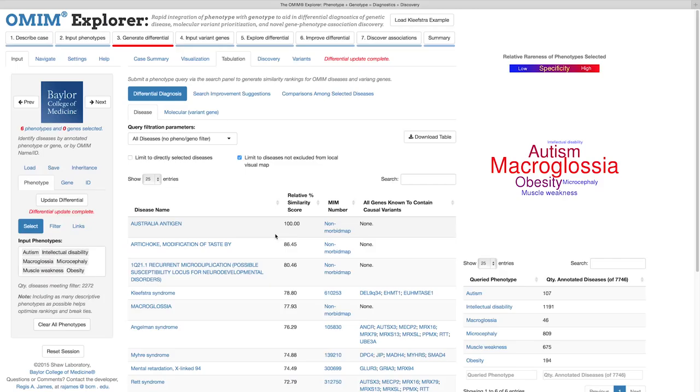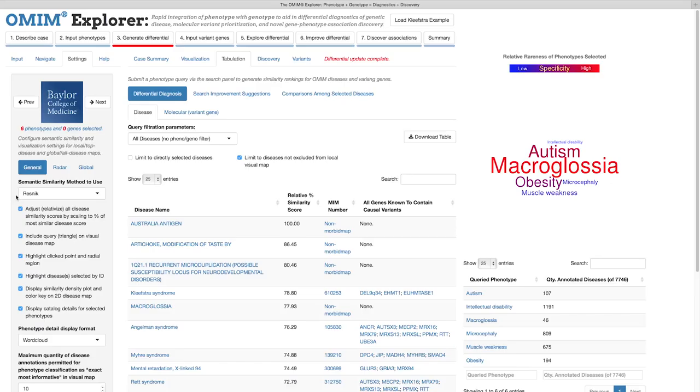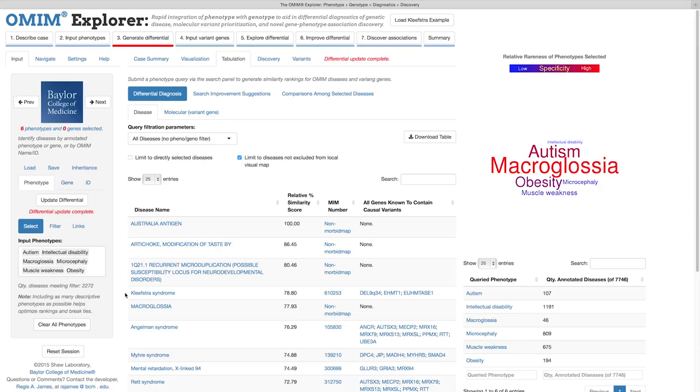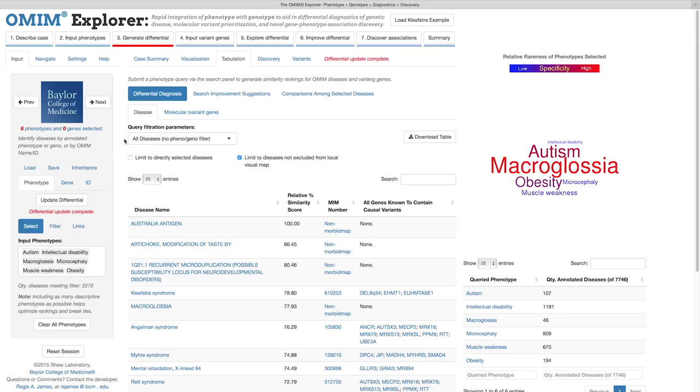The default matching method is our implementation of Resnick similarity, but this can be replaced with another in the Settings tab. Reviewing the differential, we can see that Kleefstra syndrome is already ranked within the top 10 diseases. It's important to mention that all diseases are ranked, not just those that may or may not be known to exhibit the queried phenotypes. Also note that this ranking is before any gene or phenotype filters are even applied, which could improve the ranking.